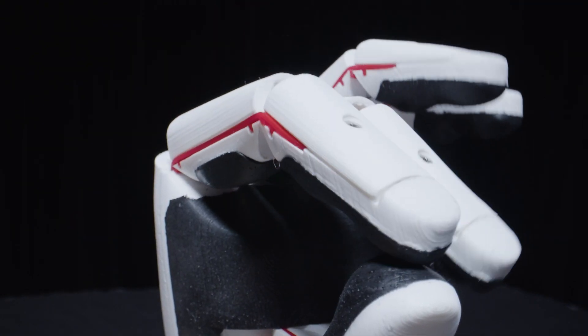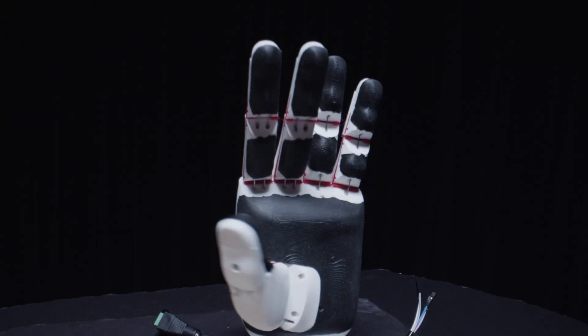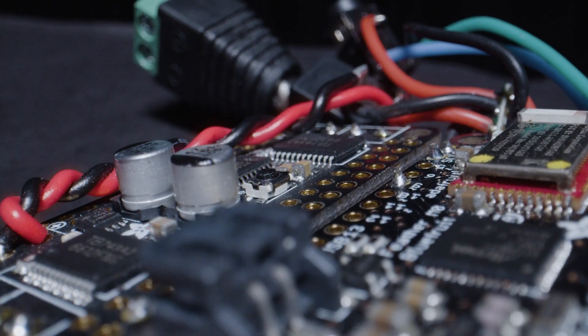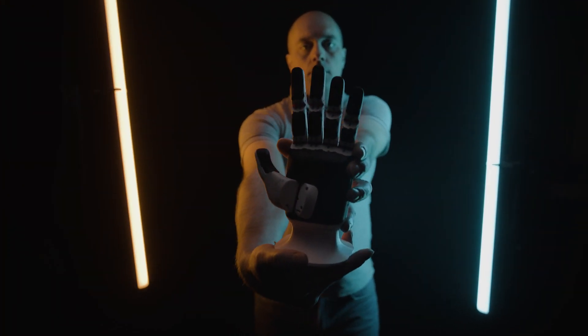Learn about 3D printing a hand — from the mechanics of movement using fishing line to flexible filament tendons connecting the fingers together — then learn how you can control it with pressure sensors, consumer IoT hardware, and a mobile app. The best part is you can do all this at home. Let's get personal computing with Cliff Aegis.